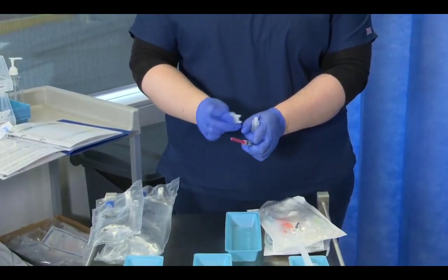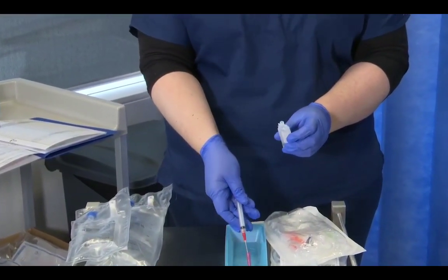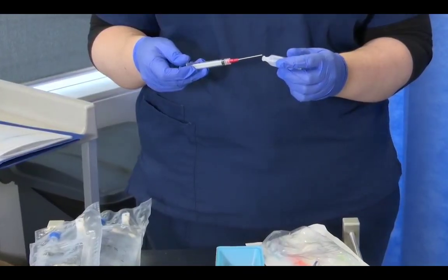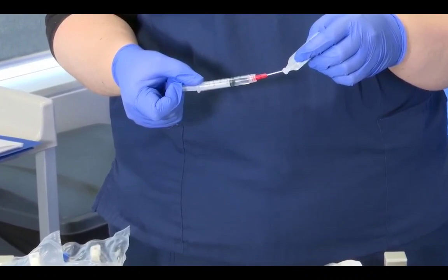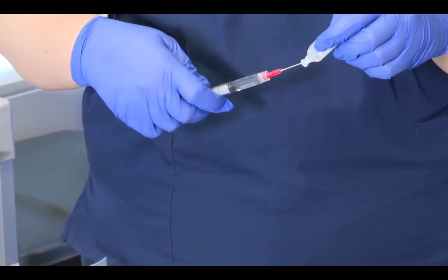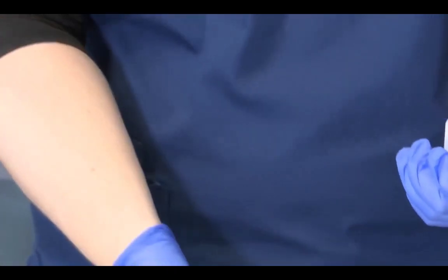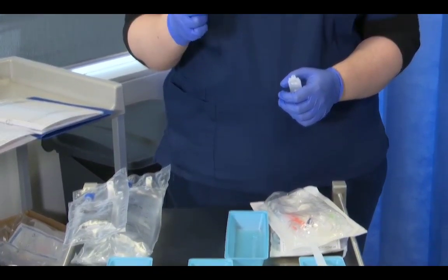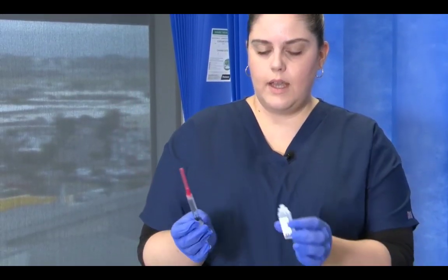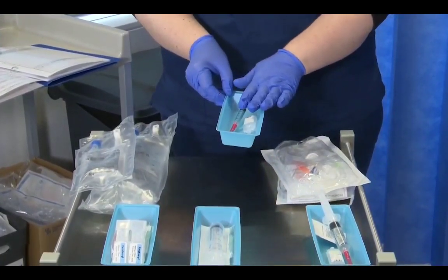The top comes off the ampule, and again the cap can be placed into the tray without touching, and the needle goes straight in without the red part of it ever touching the ampule, because remember, the ampule is not sterile, it's been sitting out on the shelf the whole time. Once we've got close to 3 ml, and remember we only need about 0.5 of a ml, we can then get our air out of our syringe, and again placing them in together so that that's ready for our third check.